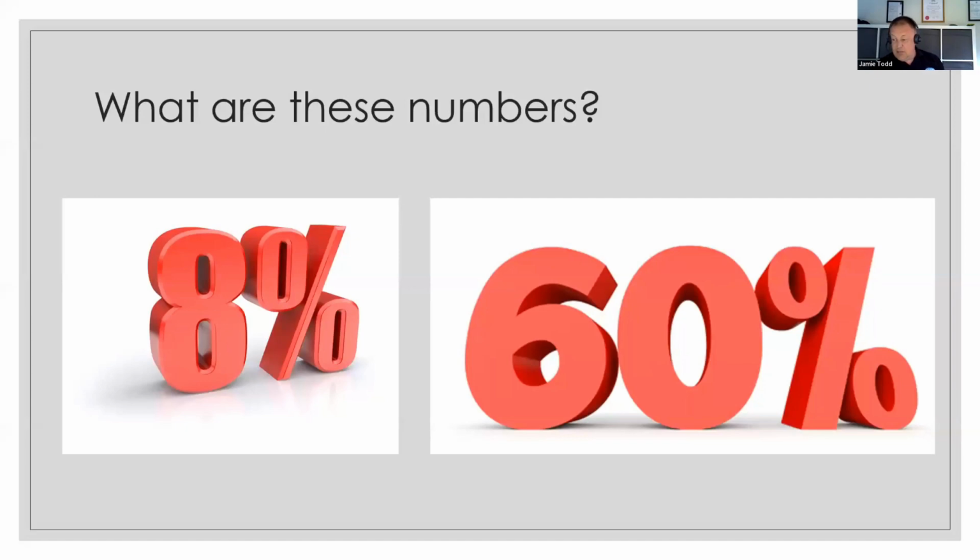If you've got £1 million to spend, buy AEDs. But we know bystander AED use is still very low here compared to other parts of Europe. Only about 1 in 10 out-of-hospital cardiac arrests in the UK receive bystander defibrillation, which is really, really low compared to other European countries. And some of that is reflective of the domestic setting, the percentage of cardiac arrests that happen in a domestic setting rather than in public or in commercial premises.